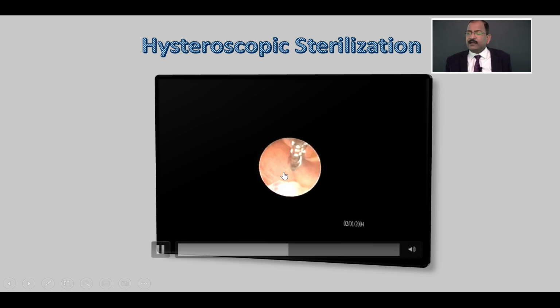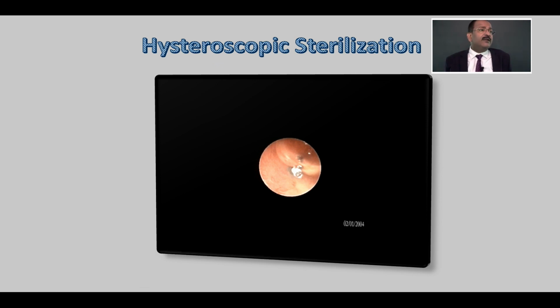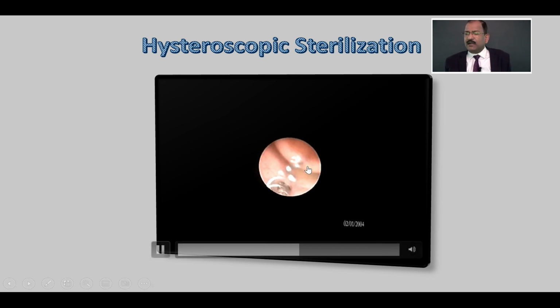This is the guide wire, this is pulled out, and now this will, just like the spring of a ball pen, it is like a coil. Nitinol is a metal which is a mixture of nickel and titanium. That is called nitinol. It is not a separate metal. Once you mix titanium and nickel, that is called nitinol. So this is done. After that, this is the nitinol part which is dwelling in the cavity.